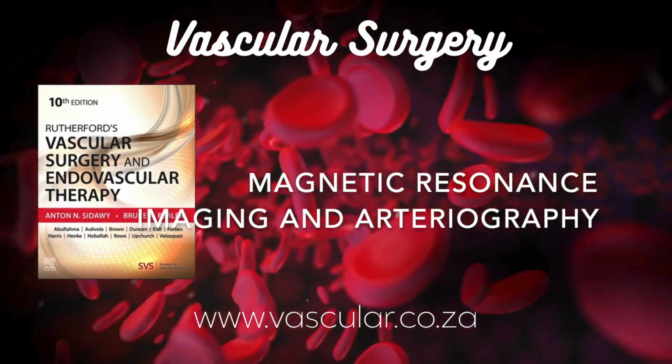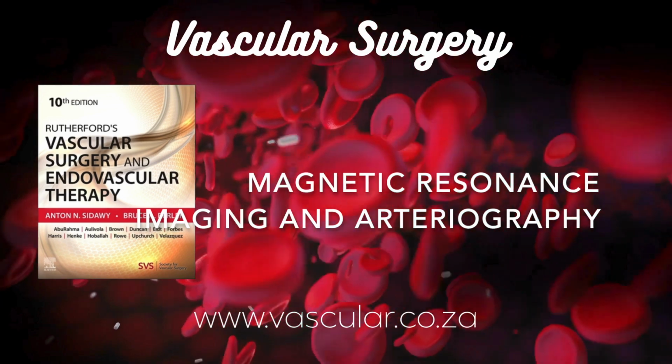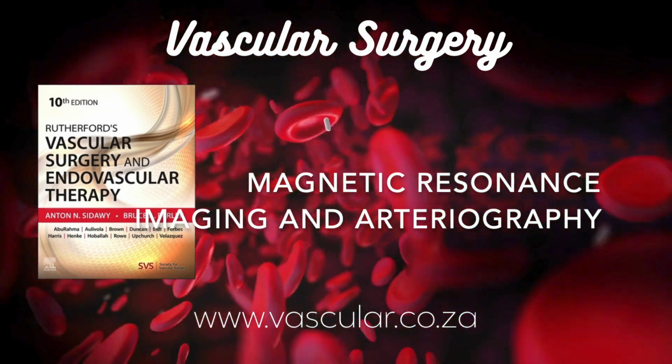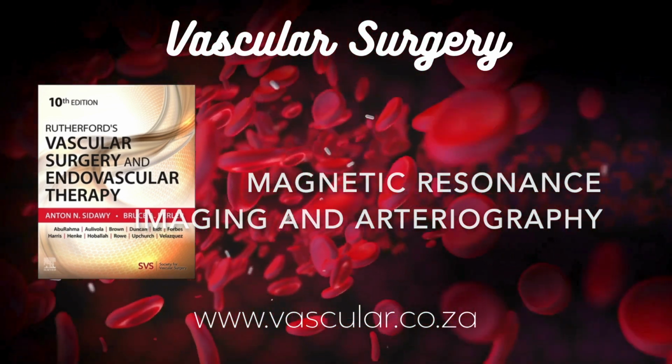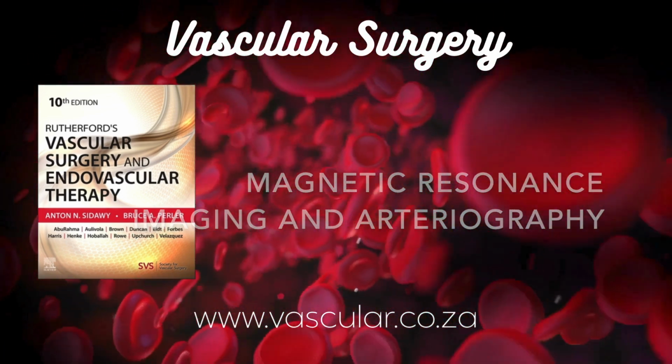Not at all. Then there's maximum intensity projection, or MIP. This is super common in MRA. How does MIP work? The algorithm essentially looks through the 3D data from a particular viewpoint, and along each line of sight, it only displays the brightest voxel, the brightest little cloud of data.